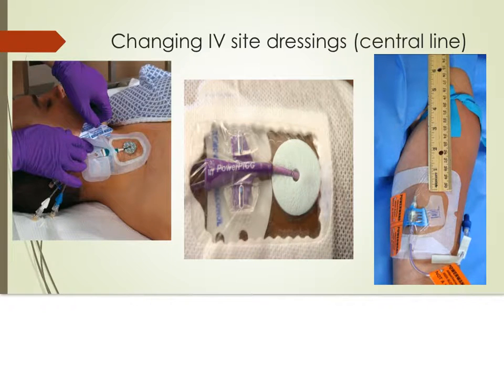During cleaning, stabilize the catheter with a non-dominant hand. This hand now becomes contaminated, and this hand cannot touch any area of the skin, hub, or lines that will be covered by the dressing. Clean for approximately 30 seconds. Allow site to completely dry before proceeding.